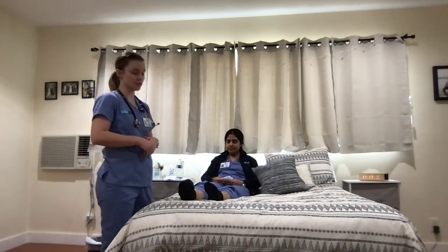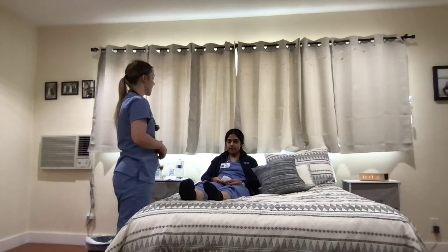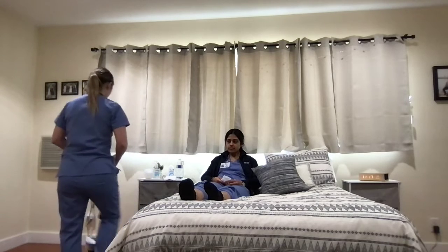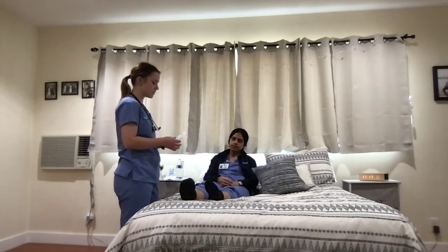Okay, so have the patient demonstrate 3 to 5 times to make sure they're doing it correctly. And then you'll do this 10 times every hour while awake in this post-op period as well. Alright, so next we're going to be doing, you can throw that away, right there. Next we'll do this incentive spirometer.